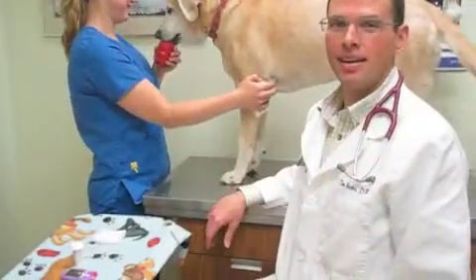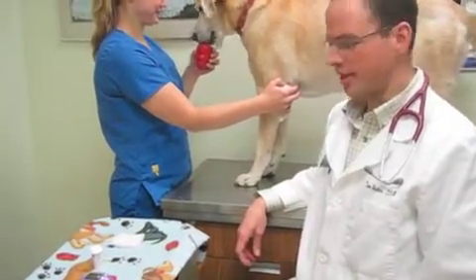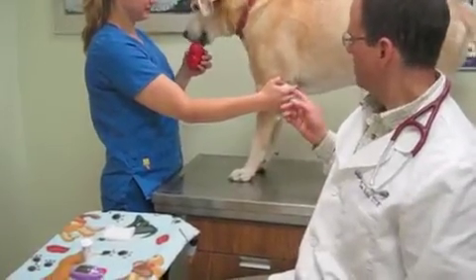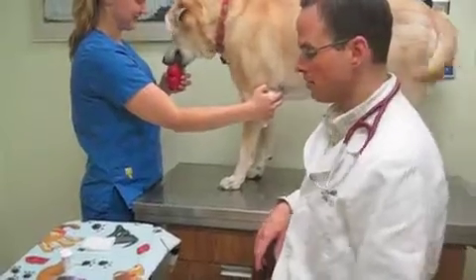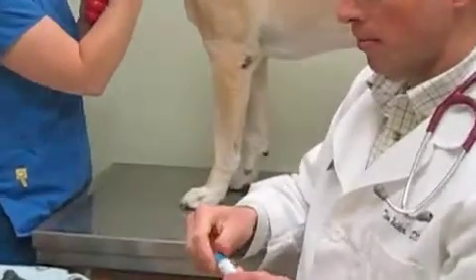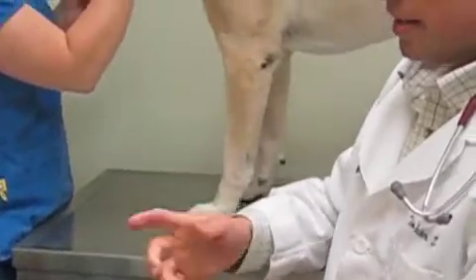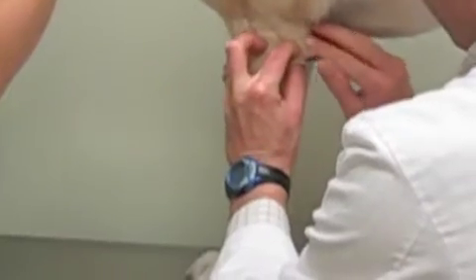So now we just need our first patient. This is Maggie, our patient with diabetes, and we're going to take a blood sample and measure the blood sugar. We have a little calm so it's fun for the patient. My assistant is already holding our little warm compress on there for 30 seconds or so. We'll take our Vaseline. We'll take the compress off and she has a nice spot here on the elbow. Your veterinarian will discuss where to take a blood sample.